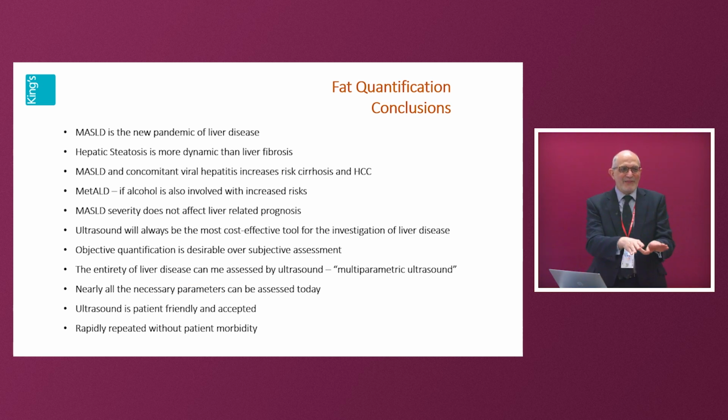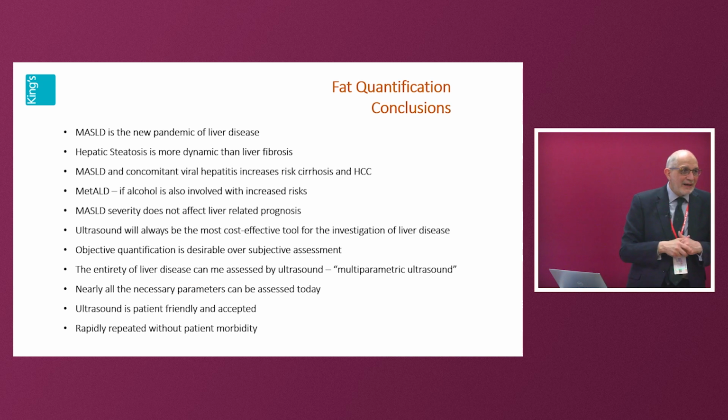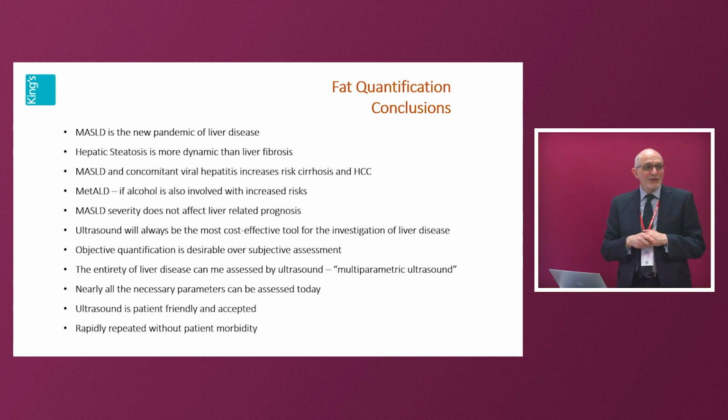Just put yourself in that position. You want to know what's going on. And if I'm scanning and I find a focal liver lesion, do you think the patient doesn't know you found something? Yeah, they're watching you. You're scanning. What are they going to do? They know it's there. So 80-90% of focal liver lesions are benign, so you can do that as well.